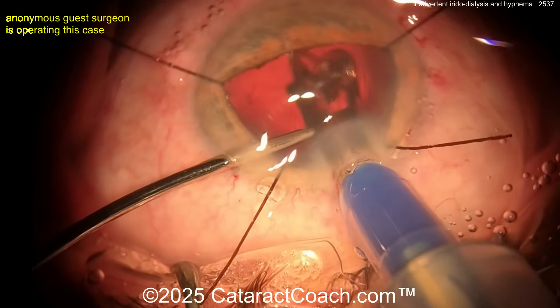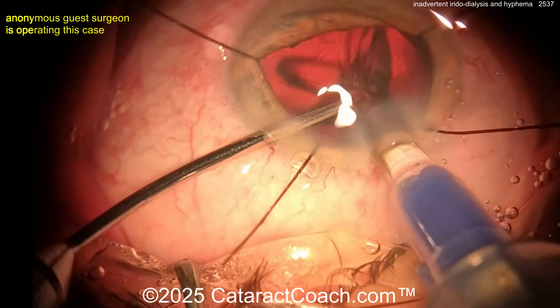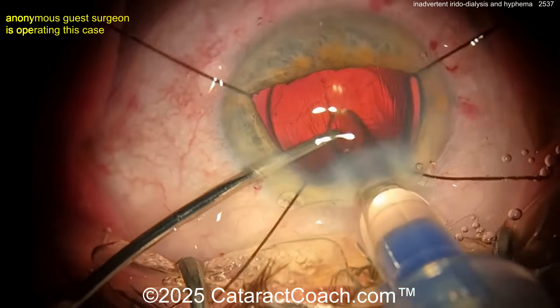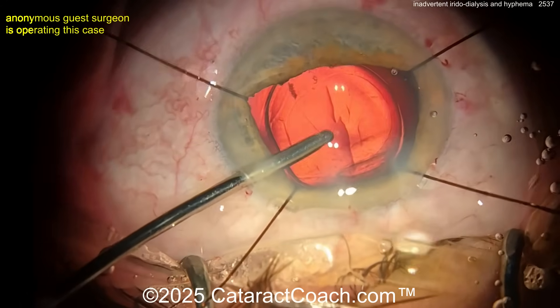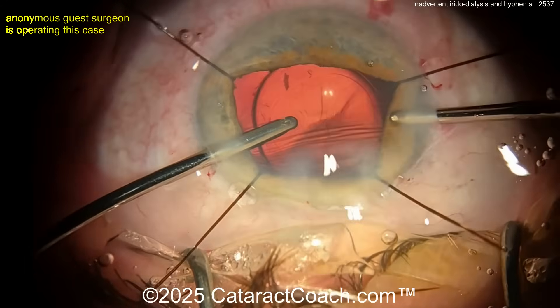Let's fast forward to the end of the case. The IOL is going in the capsular bag — a single-piece acrylic lens, a beautiful surgery. You can see a nice-looking rhexis, and you think, hey, we're done. This is going to be easy. There's the lens in — now watch carefully.